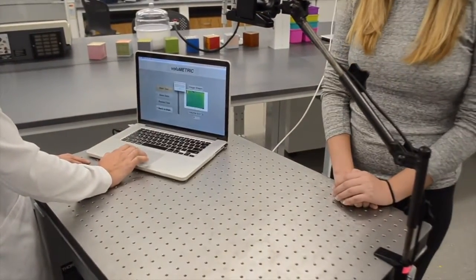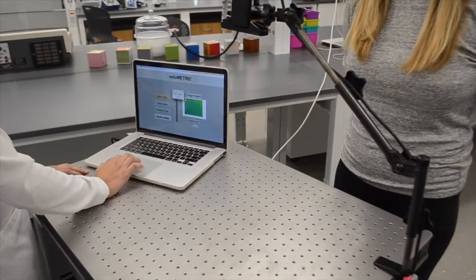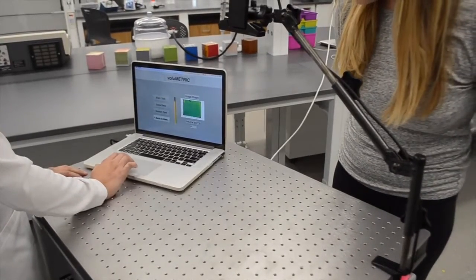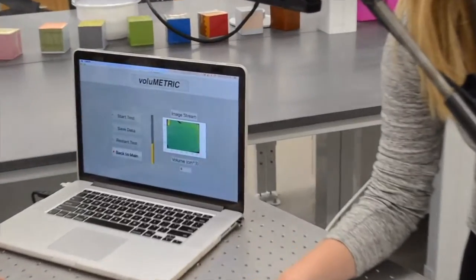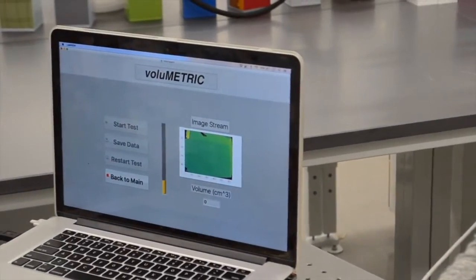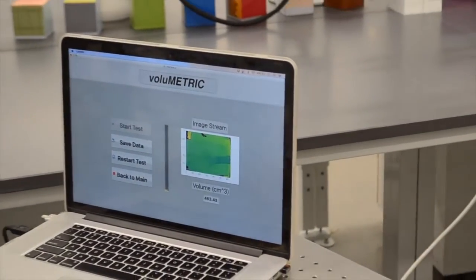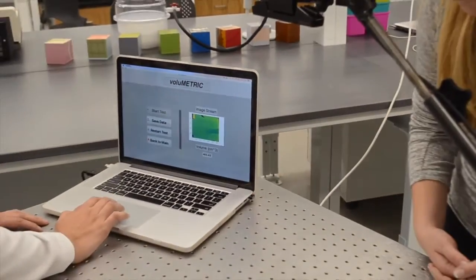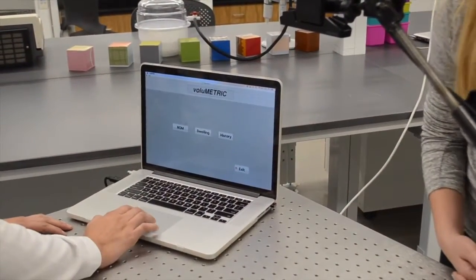The device will tell Kelly to clear the area below the camera, and then we press OK, and a calibration image is going to be taken. Now, Kelly can place her hand underneath the scanner for the volumetric image to be taken. There's a countdown clock, so patients can visually see how long it's going to take the photo, and now you can see the photo is taken, and the volume is immediately calculated. Now, we can save the data, and now at this point, we can view Kelly's history.